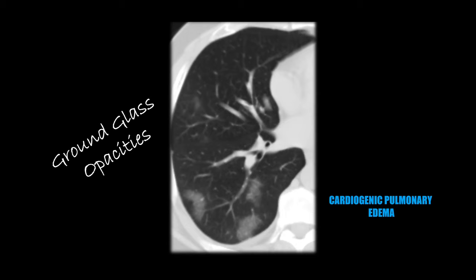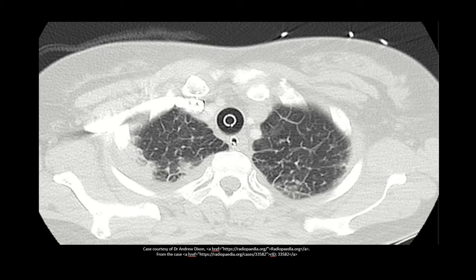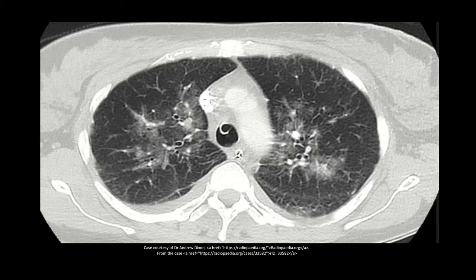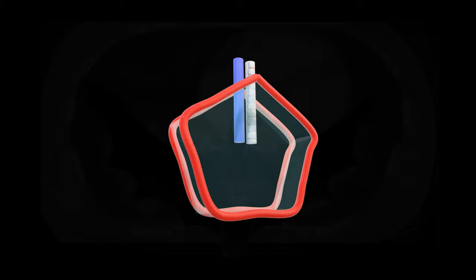That is the second phase of the cardiogenic pulmonary edema called alveolar edema. This is a patient with smooth thickening of the interlobular septa, consistent with interstitial pulmonary edema. But there is also alveolar opacities in a central peribronchovascular distribution, classic of alveolar acute pulmonary edema. This distribution of pulmonary edema is called batwing edema.